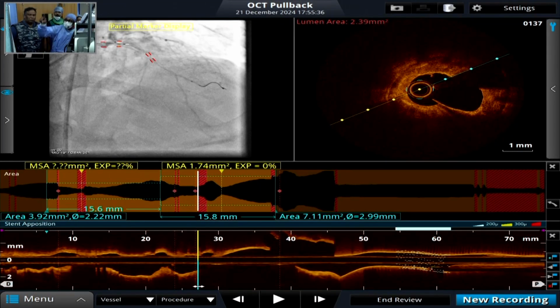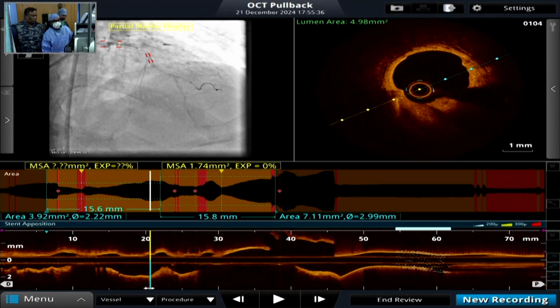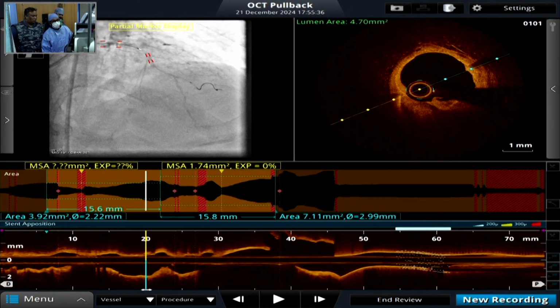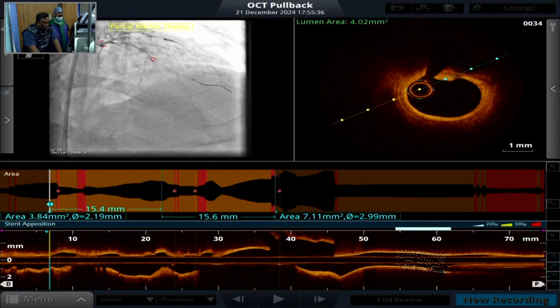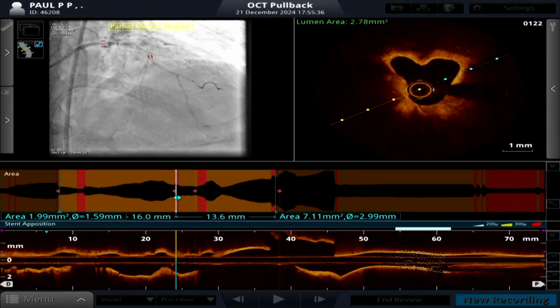I hope you can understand that. Those polished out areas are all where the orbital has shaved off the calcification. Here again at the 6 o'clock position you are seeing eccentric calcium that has been shaved off because of the catheter bias, because of the wire bias towards this calcium. So certainly we have a lumen now. We are able to dilate with a 3 balloon. Vishnu, 3 balloon. Now, shall we go with the 33 stent?